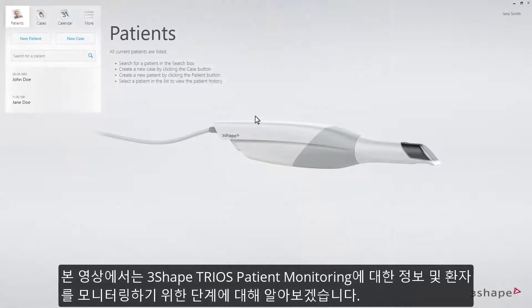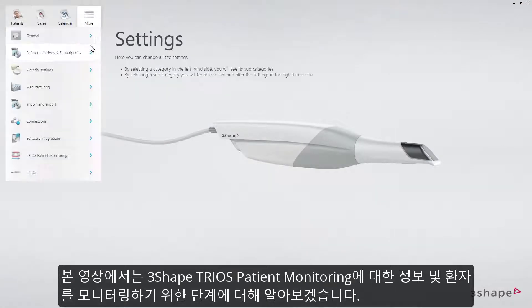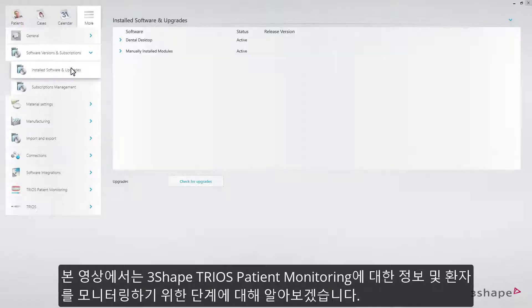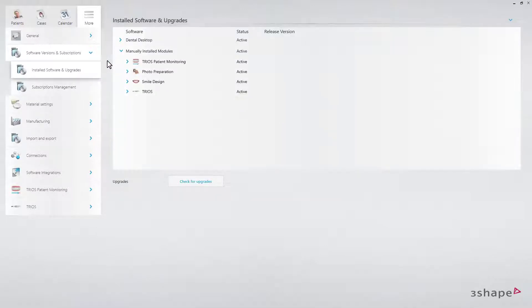This video provides an overview of 3Shape TRIOS Patient Monitoring and guides you through the steps to getting started with monitoring patients.